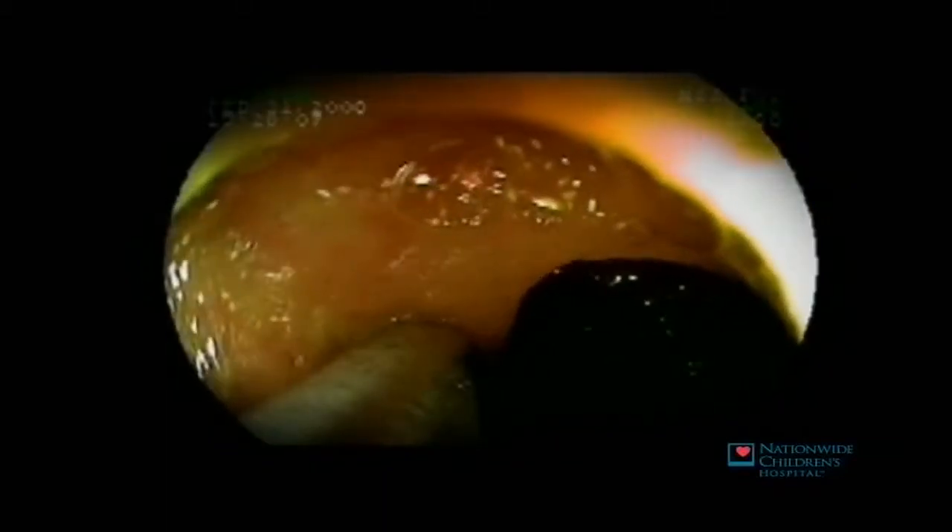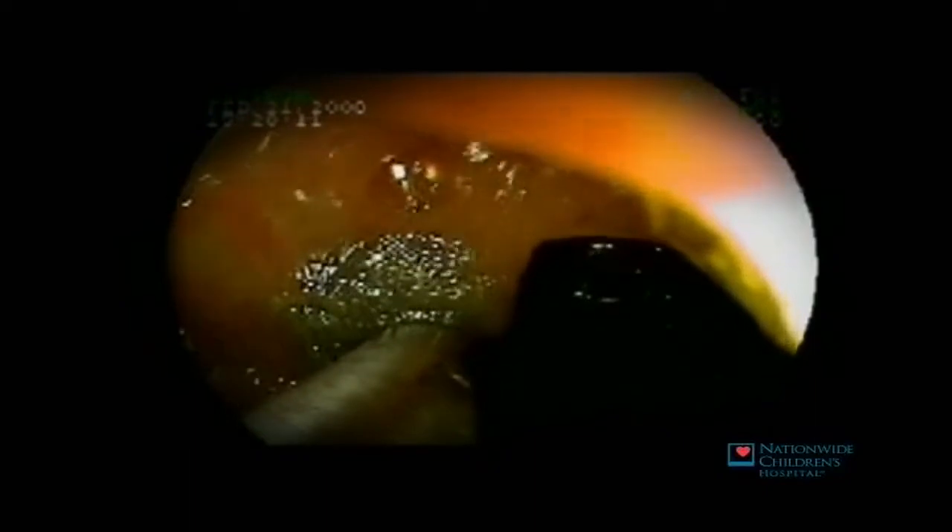Here we see a sample of the bile secretions inside the small intestine, which are the detergent that helps us dissolve and digest our food. Once we've reached our furthest distance down the small intestine, a small mark is left in the wall of the digestive tract, which then allows us to mark that spot.